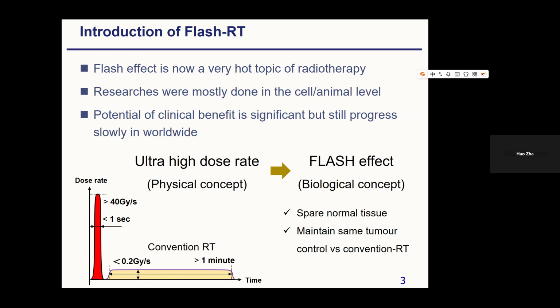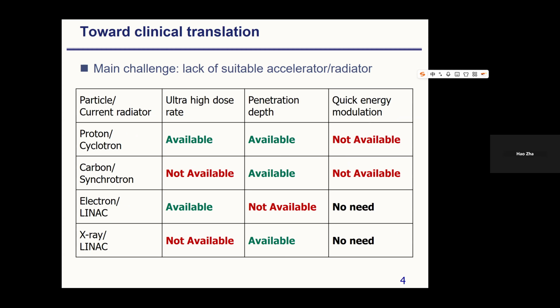But despite all the excitement, progress worldwide has been very slow. The main bottleneck is exactly what we are discussing today: the lack of suitable accelerators that can deliver ultra-high dose rate under clinically relevant conditions.